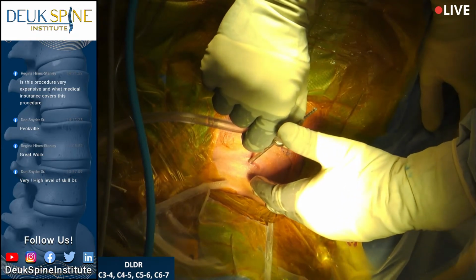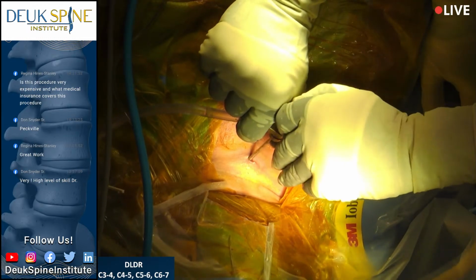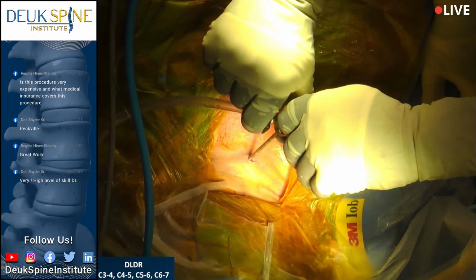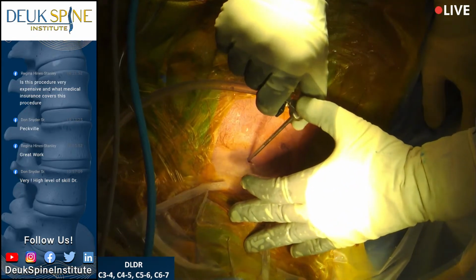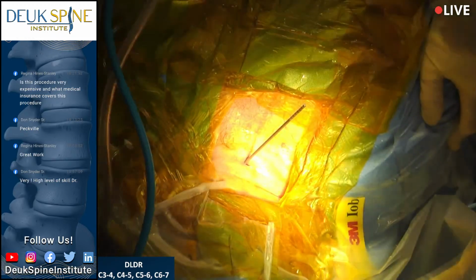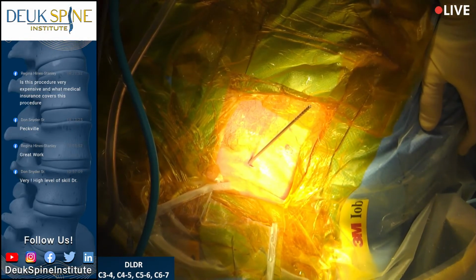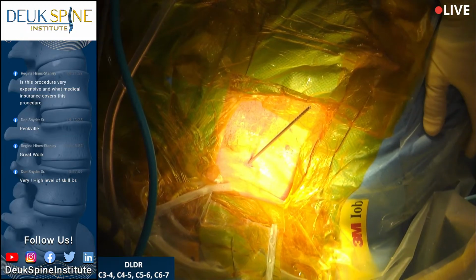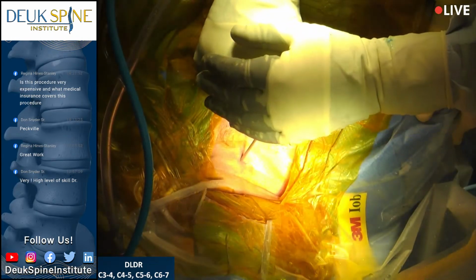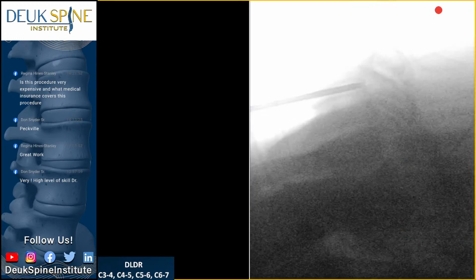Shot? Yeah, it just feels like it's grabbing on the dilator. Shot? Maybe there's a little tissue in there. All right, just about there. You know, I gotta say, I'm not gonna say anything yet, okay? But kind of impressed with the scope already. All right, now everybody ready? Everyone satisfied? Shot? I've got to see that disc space, so here we go.